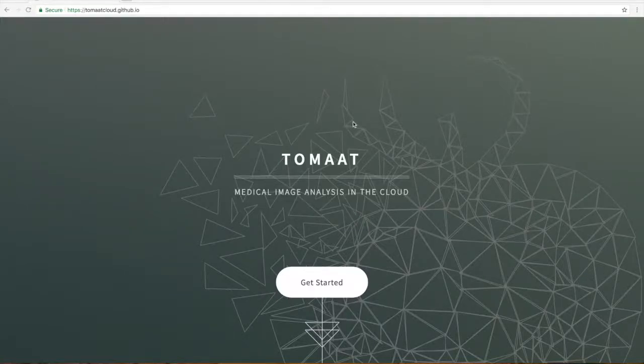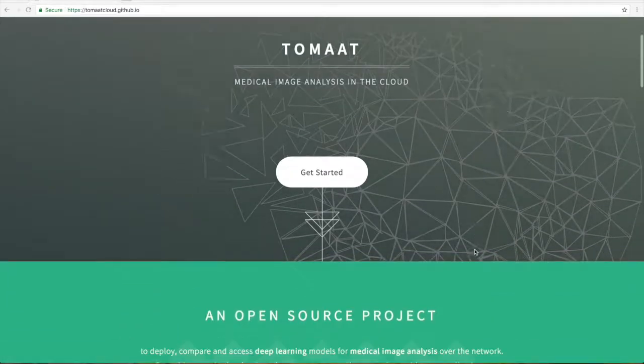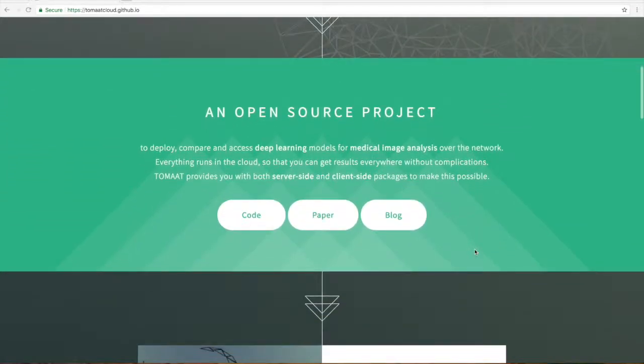This tutorial is about Tomat. Tomat is a software package that allows people to use medical image analysis algorithms in the cloud. Tomat has two parts.